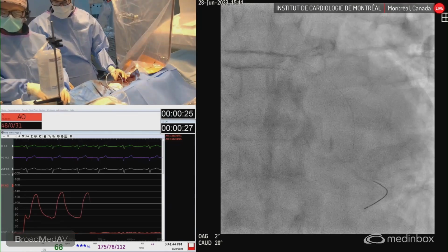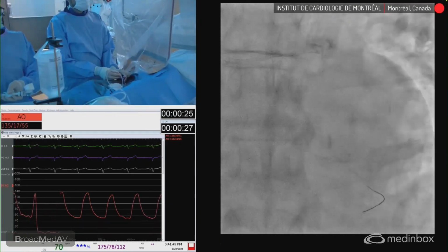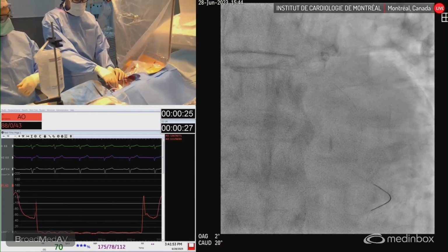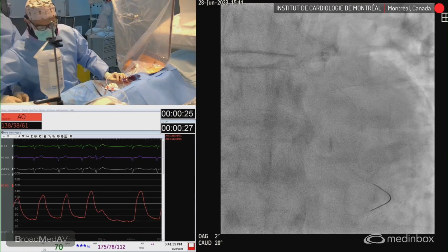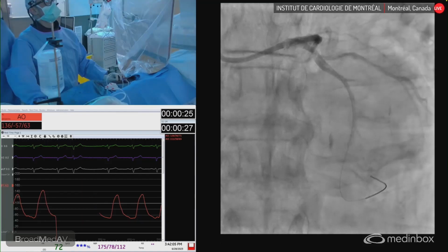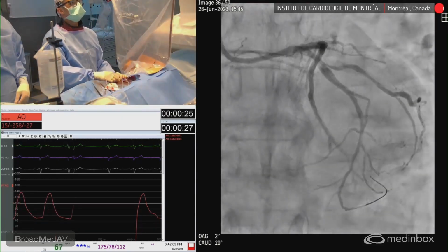25 mm. Okay. We're going to take a left main 35 by 25, or a bit longer. Megatron 35, or something longer. We can also have a clamp, please. Yeah, that's good. Okay. So IVUS measured. We see the angiogram. It appears to me it's longer than 25 though. Oh, that's nice. It looks really good.